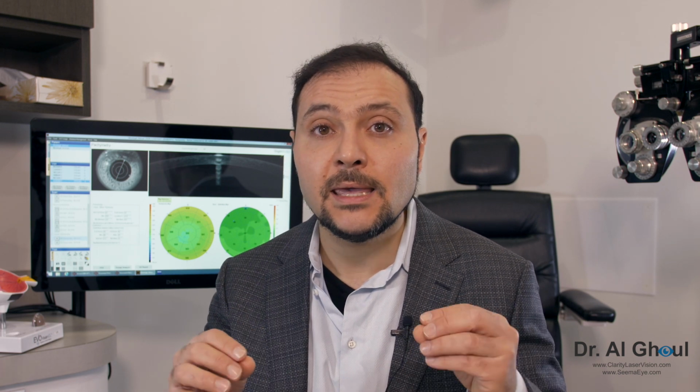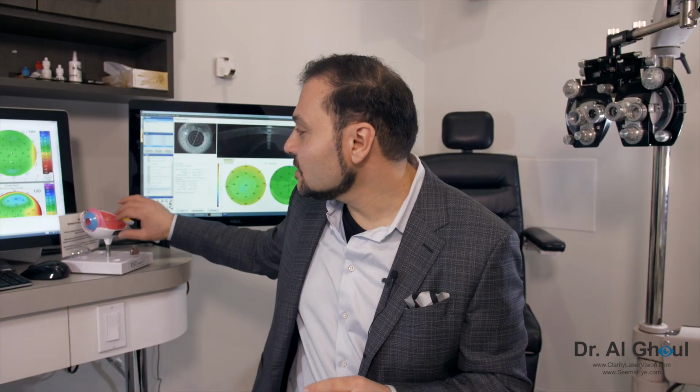Well, the nice thing is phakic ICL has been around for a fairly long time, and the notion of a phakic ICL is that we're putting a contact lens, not dissimilar to a foldable contact lens you use for correcting your vision, but instead of putting it on the eye, you're putting it in the eye. So it's an additive technology because you're actually putting a lens inside the structures that are already in the eye. So let's review the structures again just briefly.